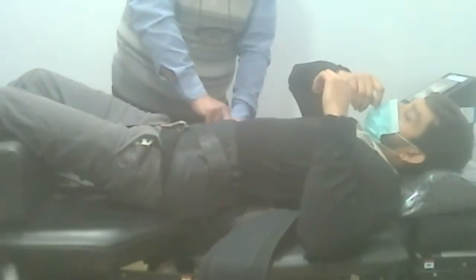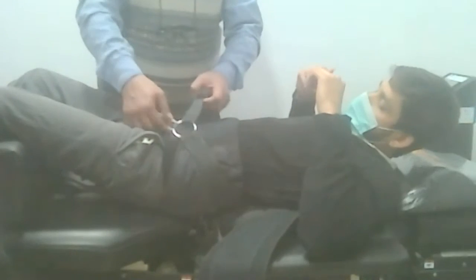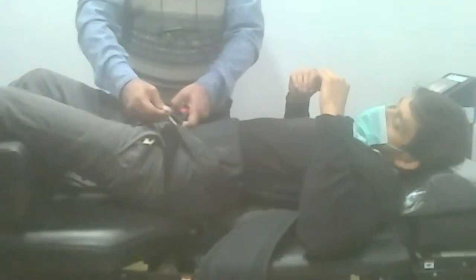Open up all your harnesses first. Okay, now press that button on the computer to bring the table back together.